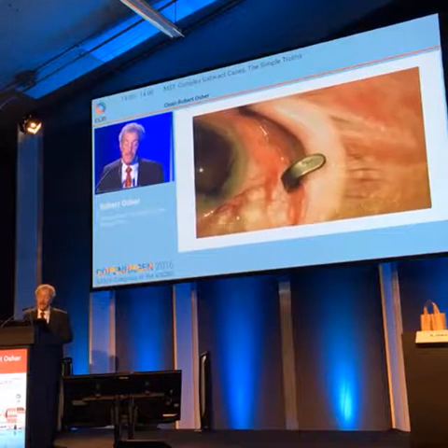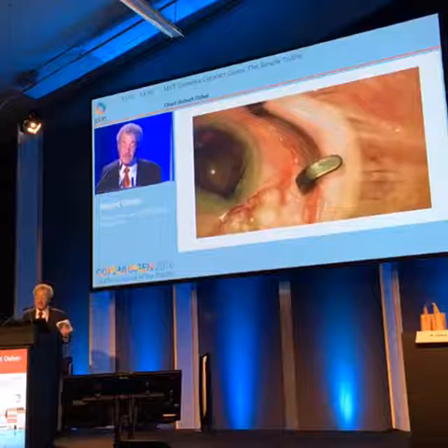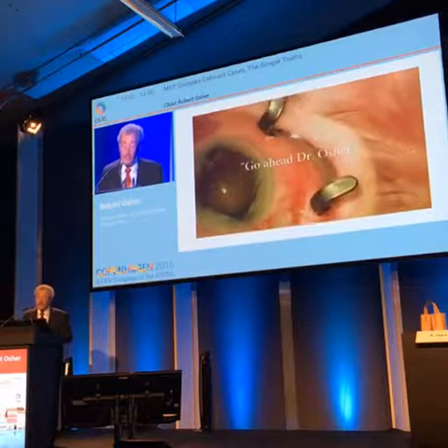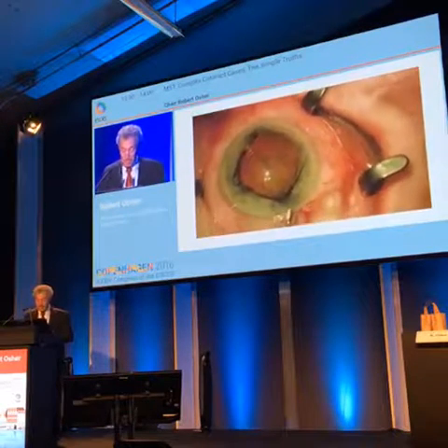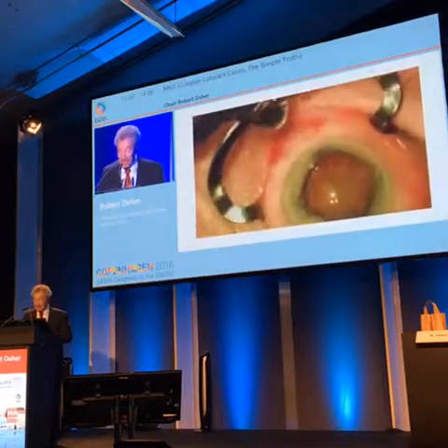And that's one of the problems we have with anesthesiologists. They want to help us, so they put our patients to sleep. And that's terrible when you've got an elderly patient. So they say, go ahead, Dr. Osher. So I'm going to go ahead now. I'll continue the case until she leaves for the second time.